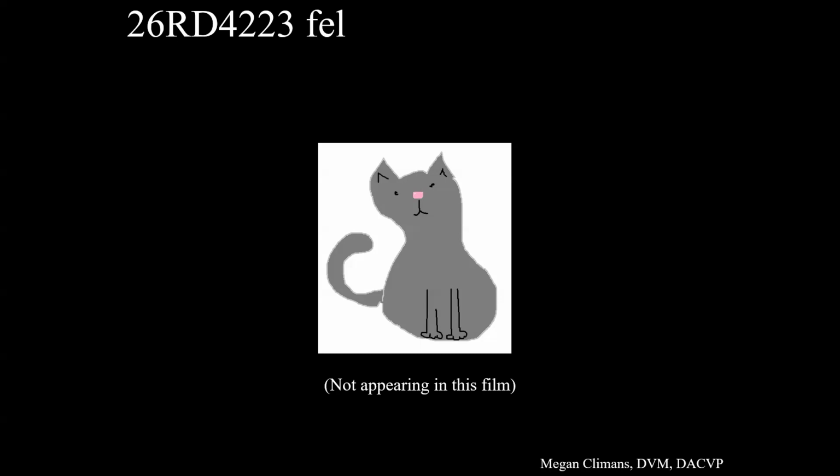They did do thoracic radiographs and abdominal ultrasound at one point, which showed no significant findings. And the patient was on prednisolone for a little bit of time before this eye was removed and submitted to us, but it ended up not affecting things in terms of our diagnosis. The other eye also has a recent partial bullous retinal detachment. So a lot of things going on in this patient.